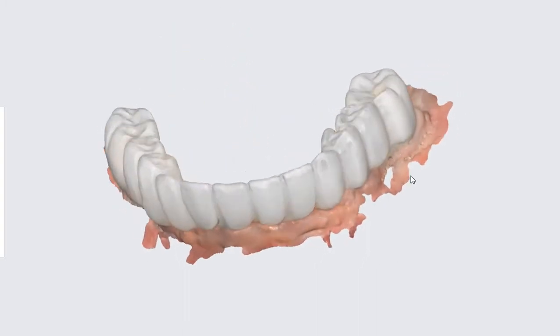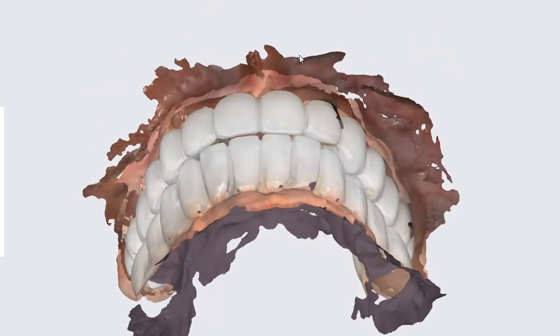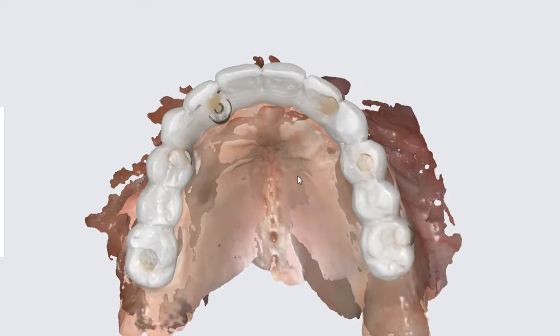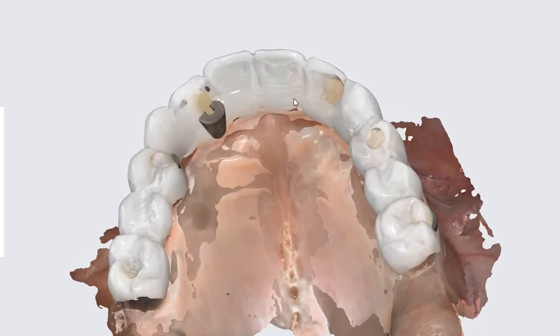I'll make all those adjustments on the provisionals themselves, and then scan the opposing arch and make any changes as needed. What we'll do is scan the whole arch and the palate. You can see I made some changes to the thickness of this area.